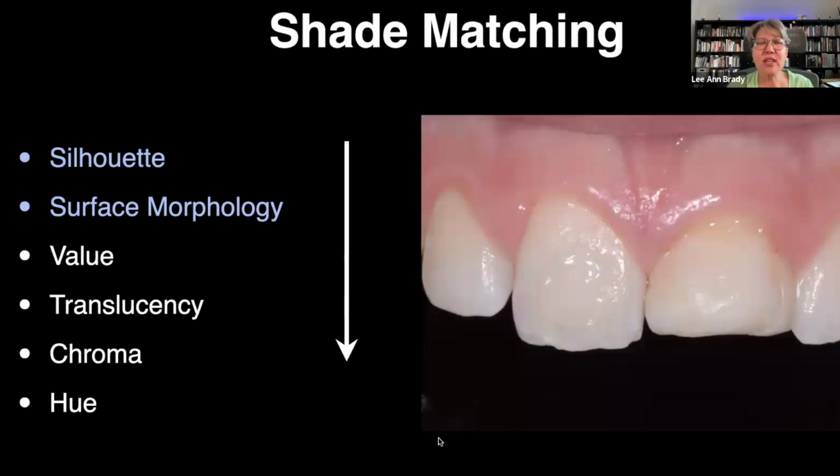And so, one of the things that I highly, highly encourage is when you're trying to match the color of composite for a composite that's going to be through to the labial or the incisal edge in the aesthetic zone, you've got to do it at the front end of the appointment and put the composite on adjacent teeth or on the tooth you're trying to match.